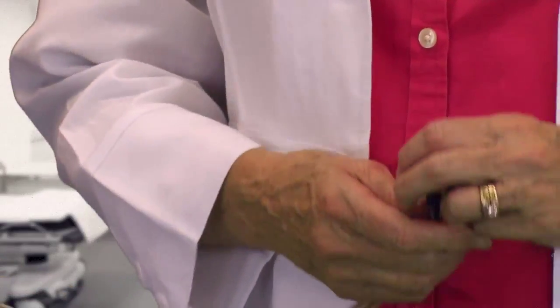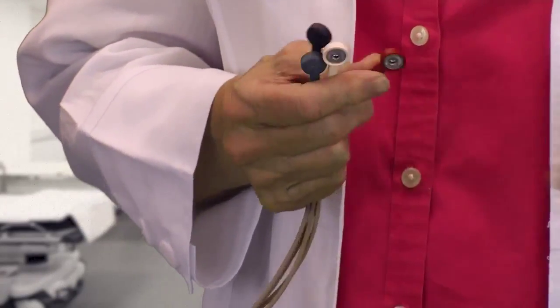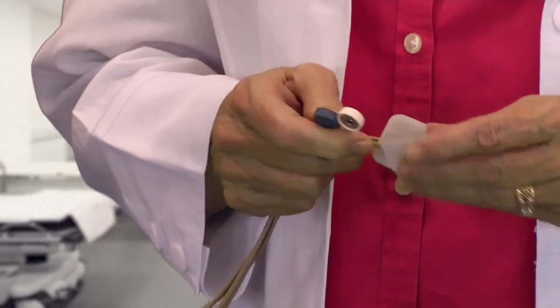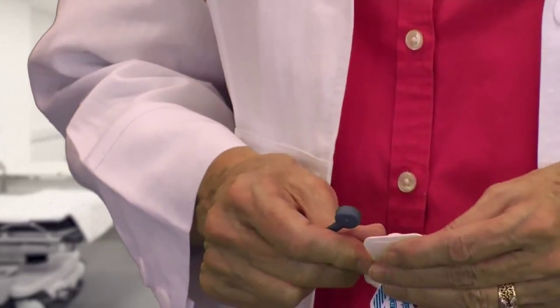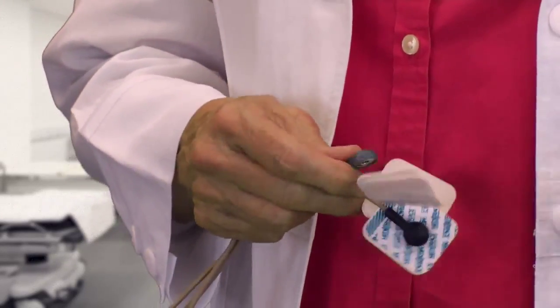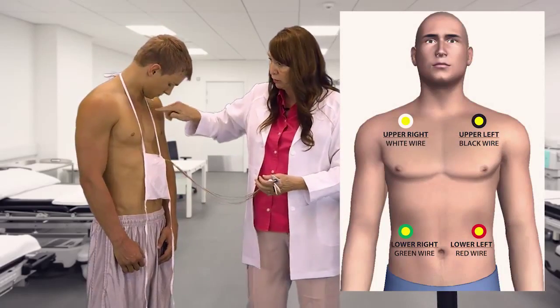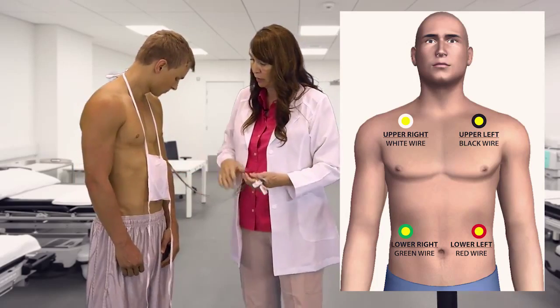The easiest way to do this is to put these electrodes on the wires instead of the skin right away, because it will be discomfort on your sternum. They snap right on. So where I'm going to put them — I'm going to put one here, one here, one here, and one here.